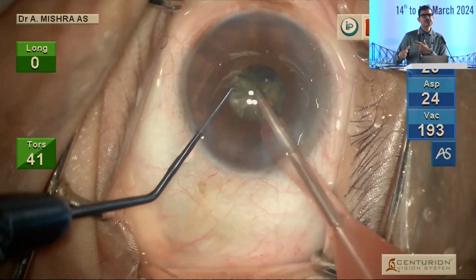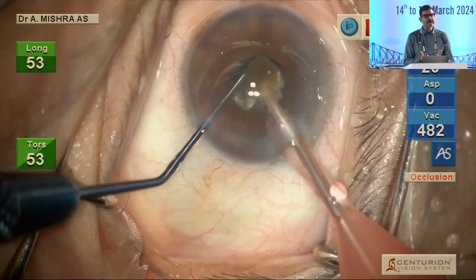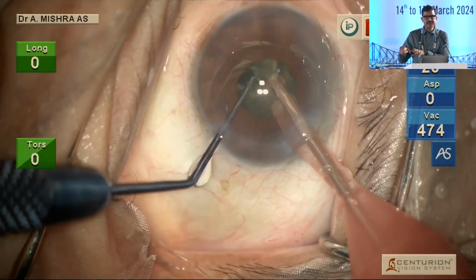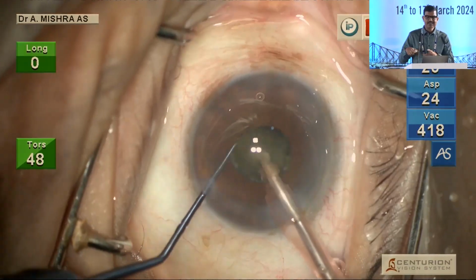Nothing much needs to change on the parameter front. As you can see, the IOP still is maintained at 20. There's a pretty hard nucleus. The pupil is small. You just need to understand that the business area is right at the center, and you don't need to go chasing the nuclear pieces, and they just come into you.